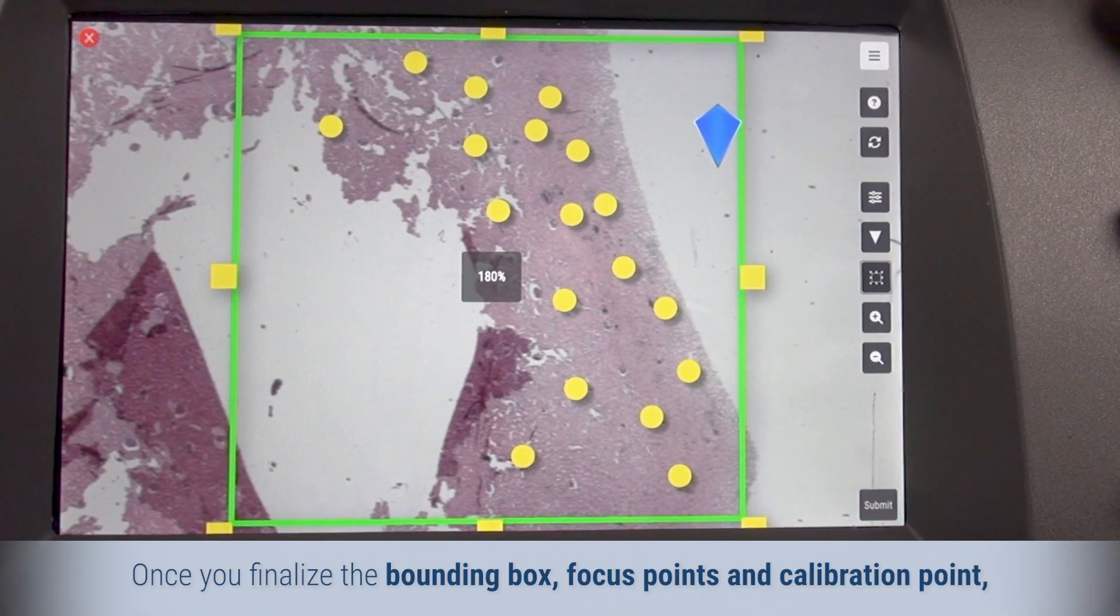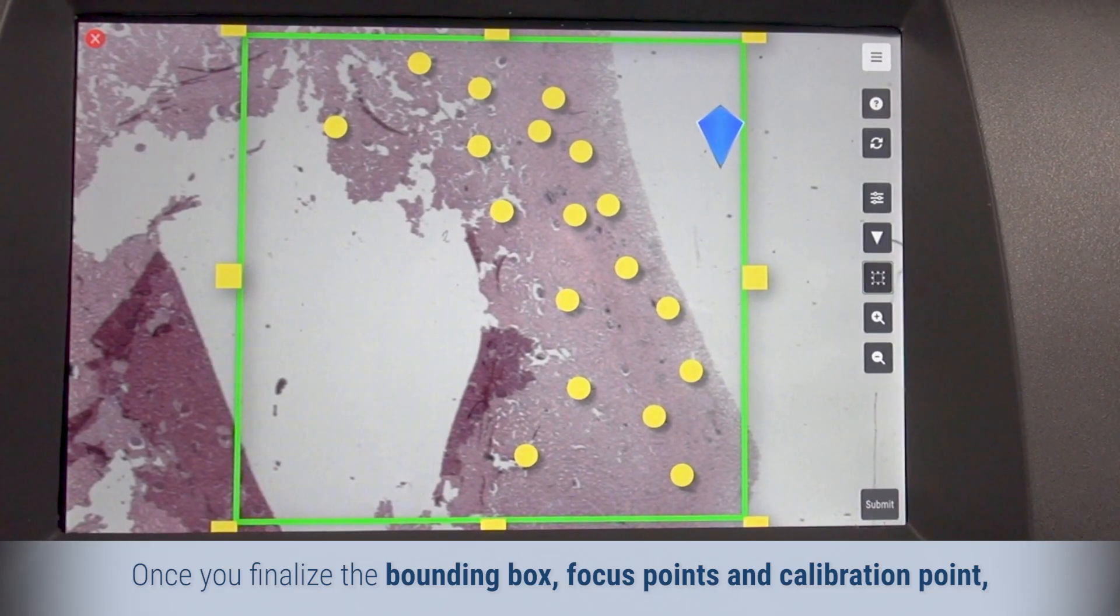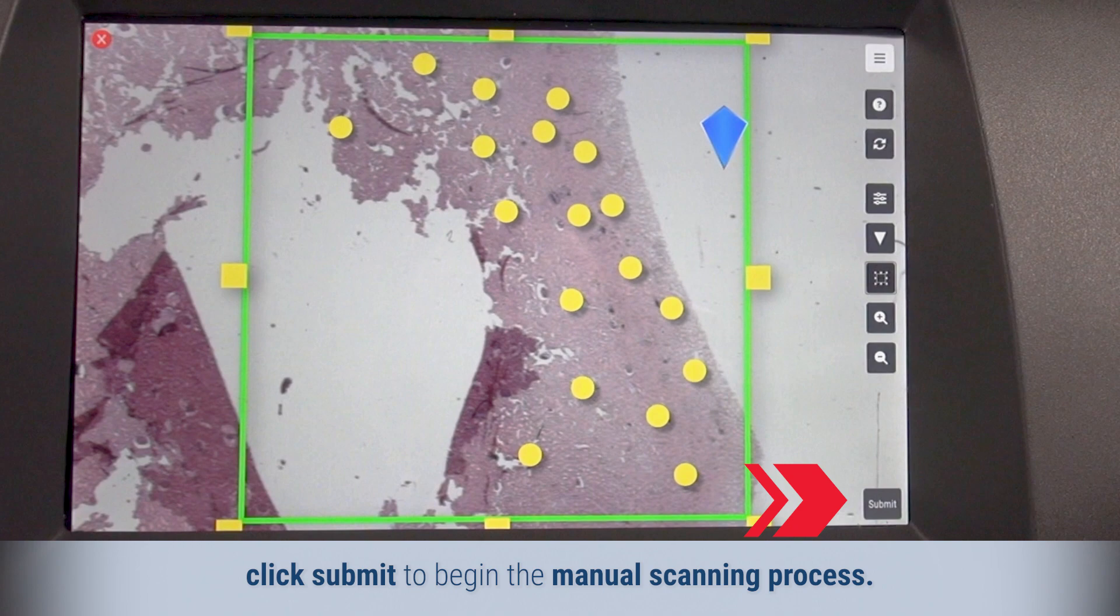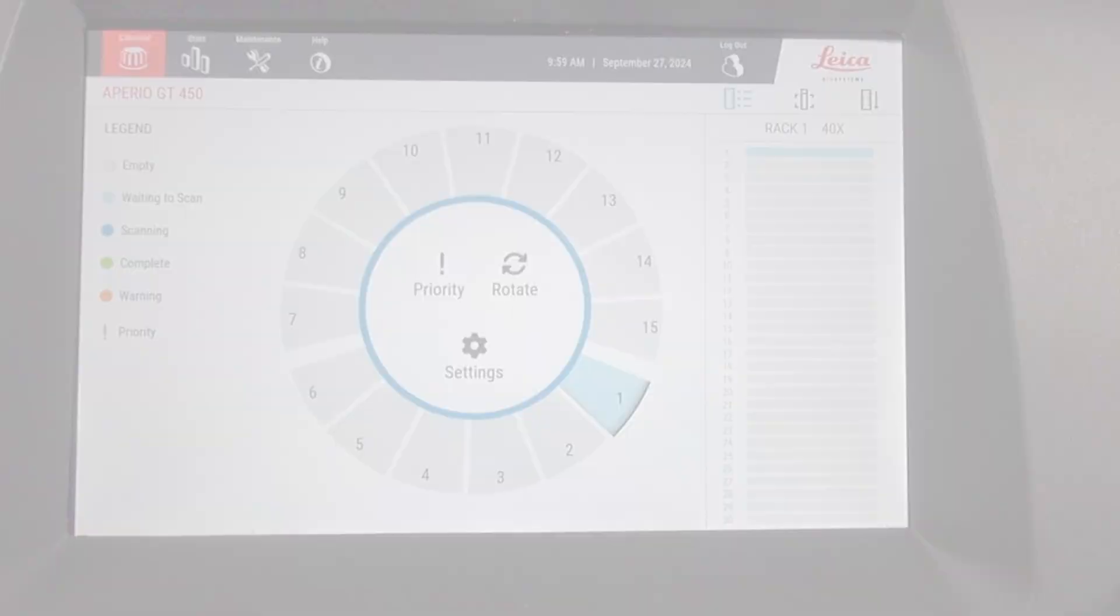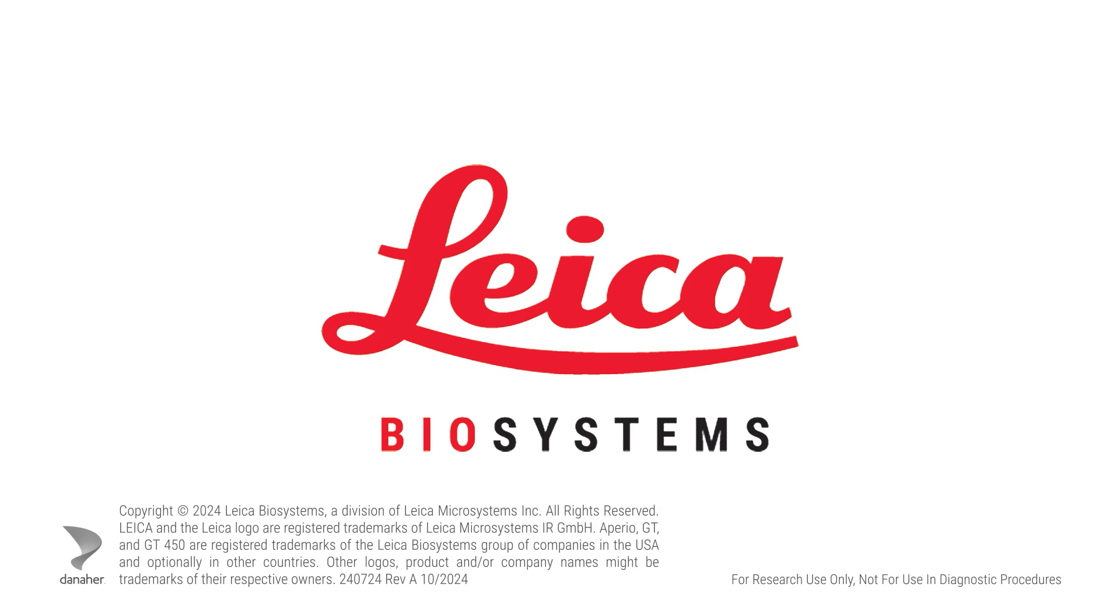Once you've finalized the bounding box, focus points, and calibration point, click Submit to begin the manual scanning process.